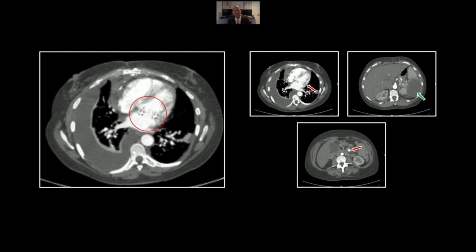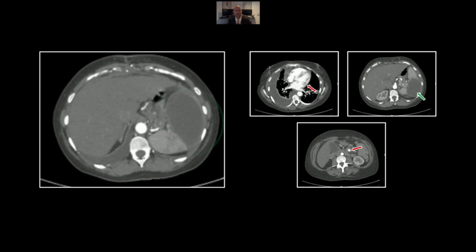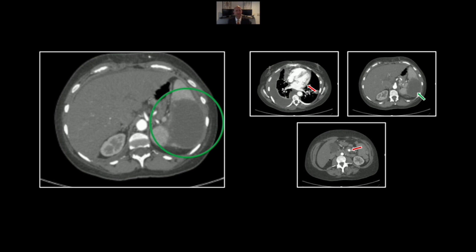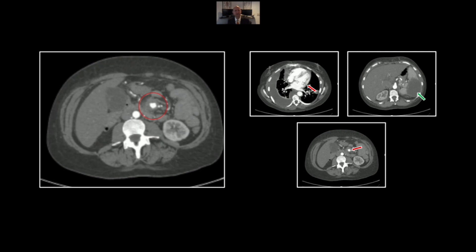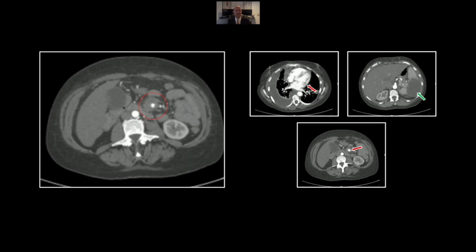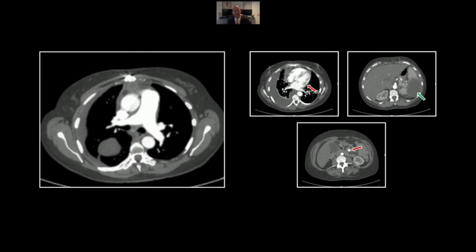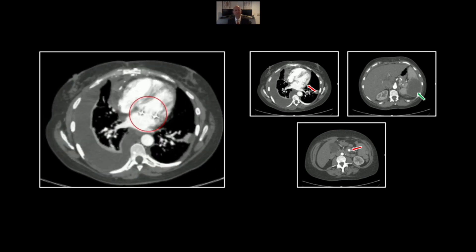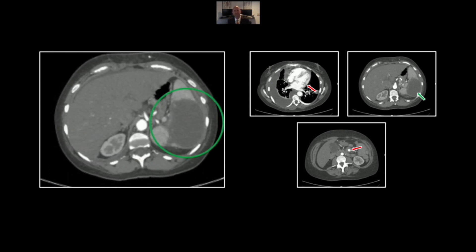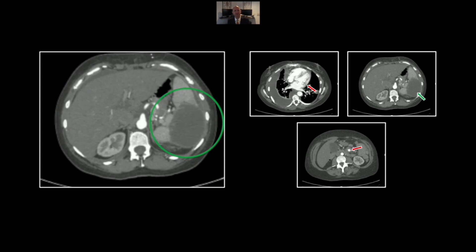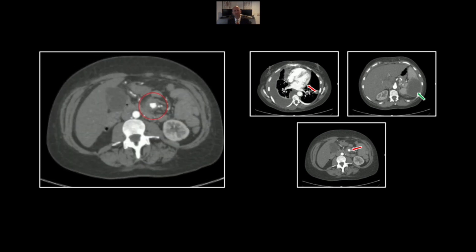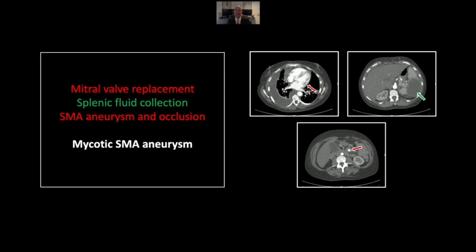There is the mitral valve replacement. Splenic collection suggestive of abscess. Now follow the SMA — here you see it dilate, and then its distal occlusion. That is a superior mesenteric artery mycotic aneurysm. Look at the course of the SMA one last time — there it is. Mycotic SMA aneurysm. Note that mitral valve replacement really can tip you to a number of entities.